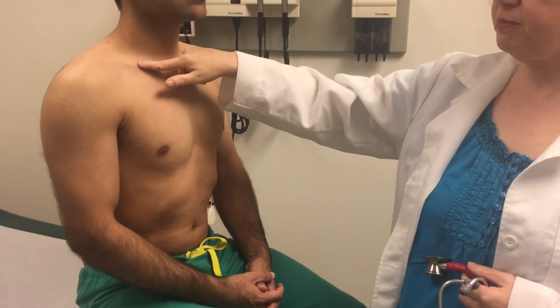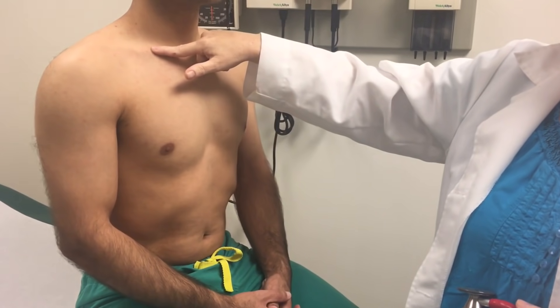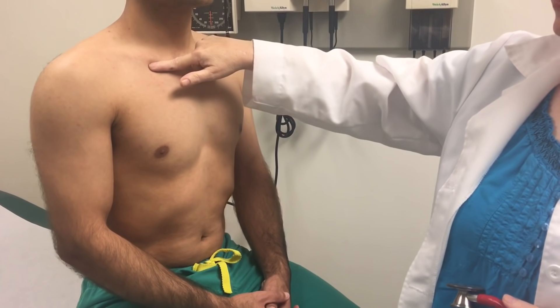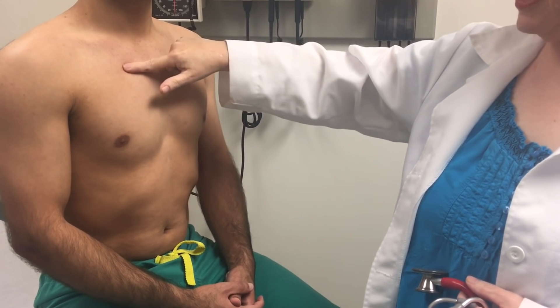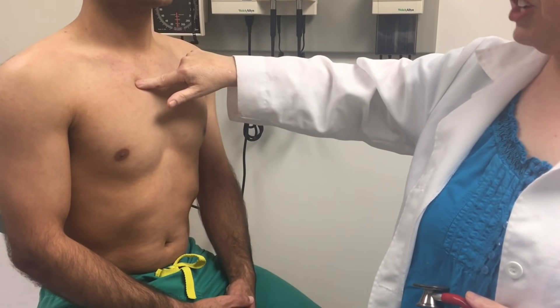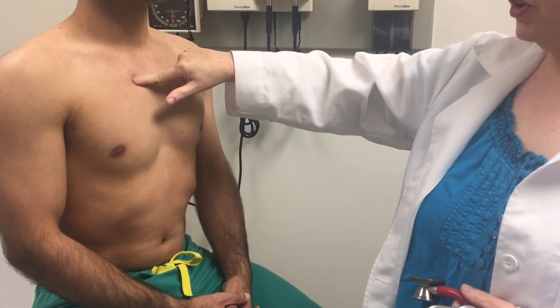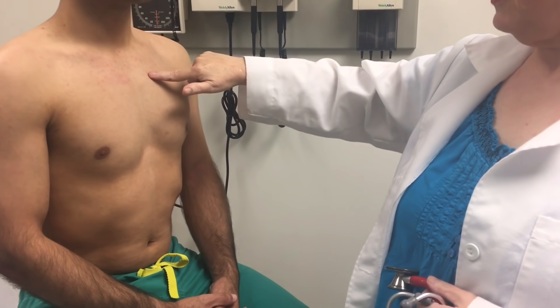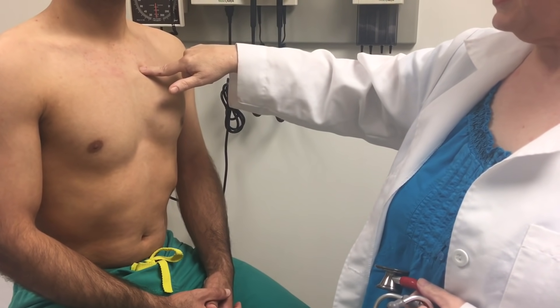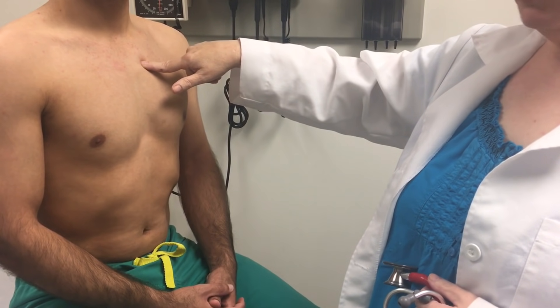The first listening post is the aortic valve, located on the right sternal border at the second intercostal space. Assuming that his first rib is just posterior to the clavicle, this is the first intercostal space, and there is the second intercostal space. Going over until just at the sternal border, and then listening directly across at the second intercostal space on the left — this is the pulmonic valve.